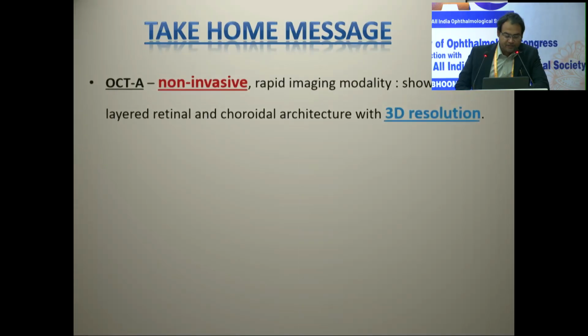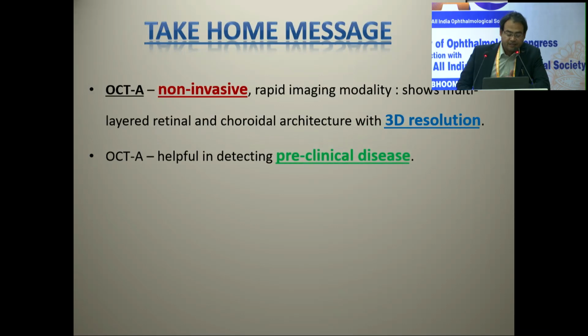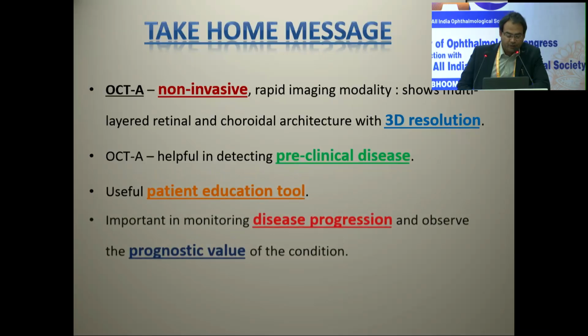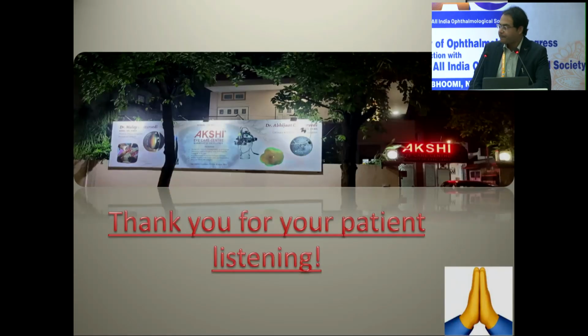My take-home message is that it is a non-invasive modality. It shows beautifully the retinal and choroidal architecture. It is very helpful in detecting preclinical disease, which no other modality offers till now. It is a very good patient education tool, and it helps in monitoring disease progression and observing the prognostic value of the condition. Thank you for your patient listening.